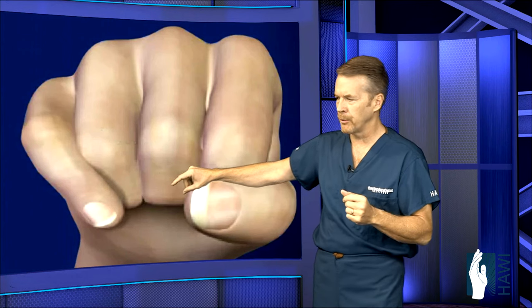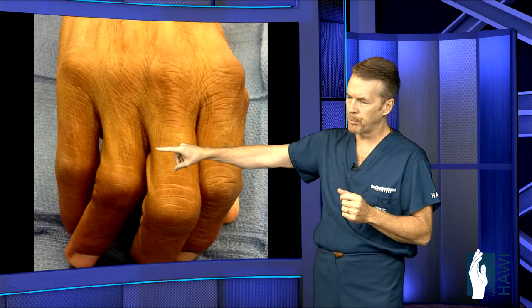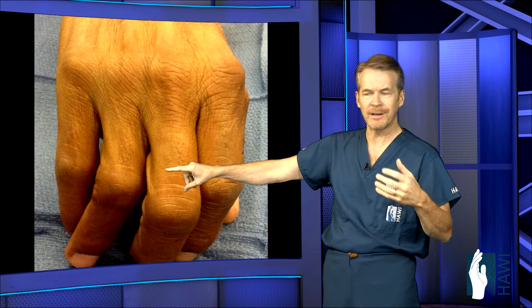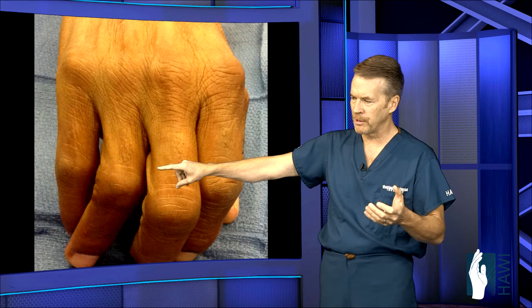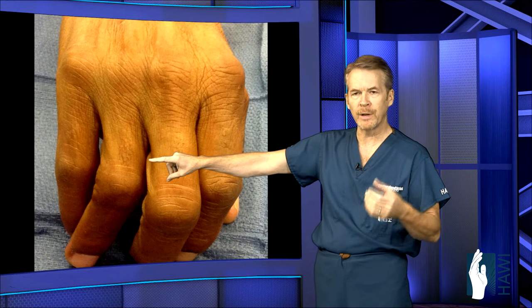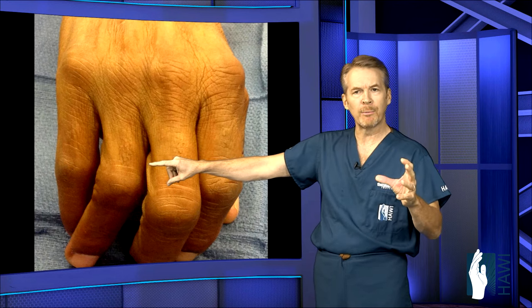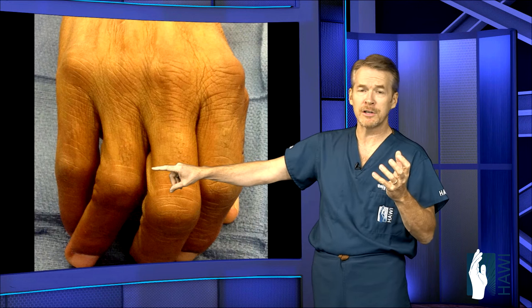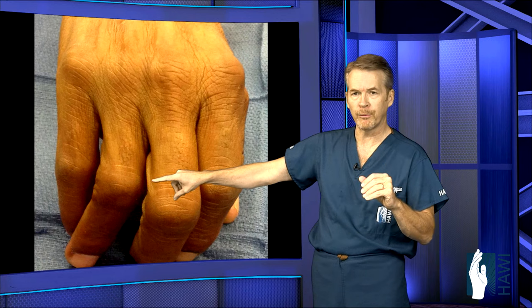This gentleman was a musician who had broken his finger and didn't get medical treatment for the first couple of months — it healed in a crooked position. Look at the significant deformity, all from a break right here. So we had to go back in, re-break the bone, reposition it, and put a plate and screws in to correct it, because as a musician he had significant problems with this deformity.